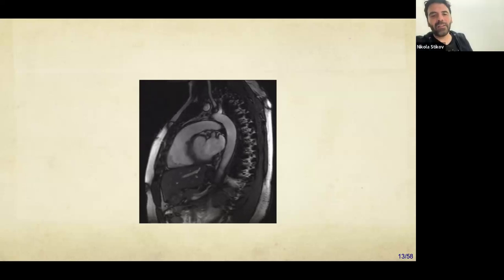No, it's seconds. Yeah. So what we do in that case is something called gating. Basically, we use an ECG trigger to find out how to locate the exact time point when the heart starts to beat, or systole, diastole, different kinds of phases of the heartbeat. And then what you do is you average over a lot of the same time points. The trigger says image now, and then you image.